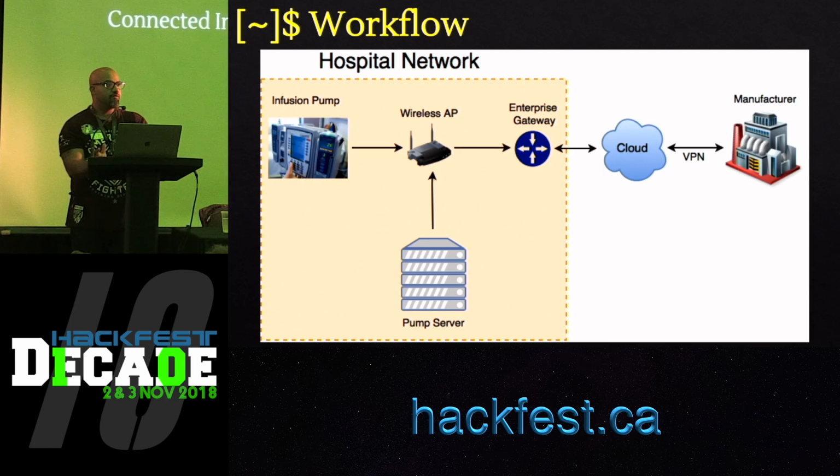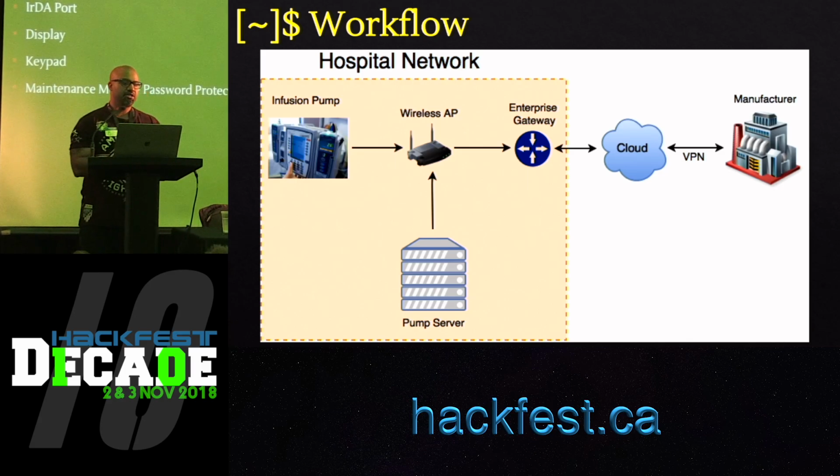In our lab setup, we just had an infusion pump, so it wasn't connected to any network. We didn't have any pump server or any other components that usually talk to the infusion pump. So all we had was an infusion pump. In the lab, we made some initial observations.